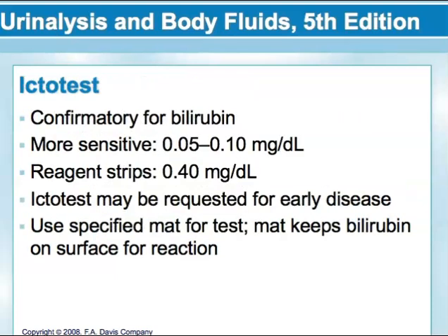And Ictotest, so I think this was the last confirmatory or backup test that we referred to in lecture 1. It's a confirmatory test for bilirubin. The test consists of special test pads and tablets, and a blue or purple reaction is considered a positive.